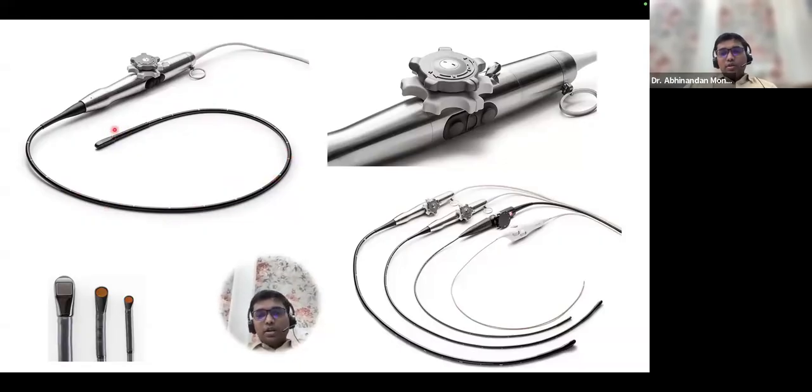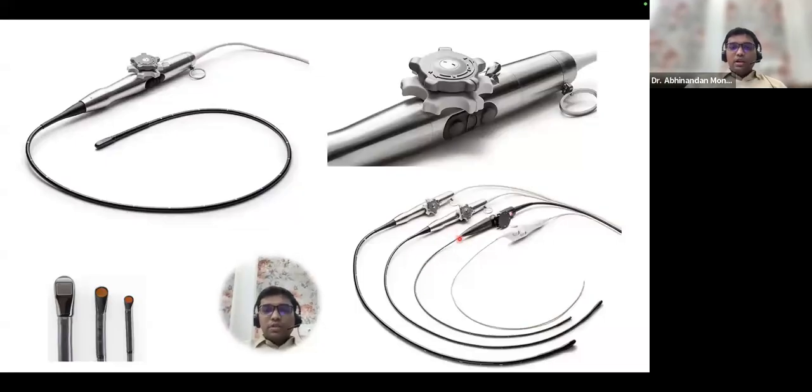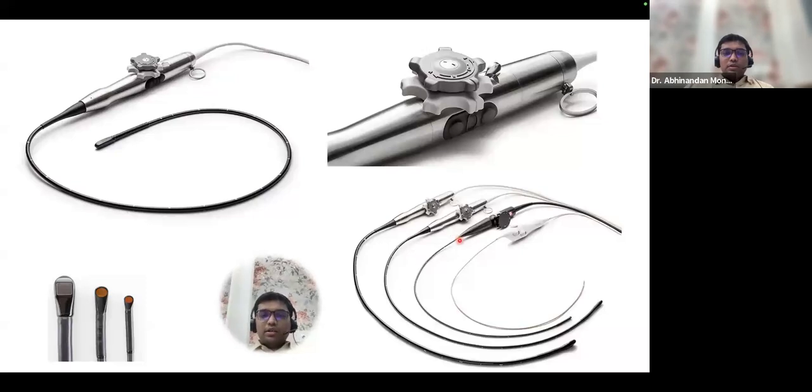And in case of pediatric, you can see in these images there are multiple pediatric options available right now. So that length is around 88 centimeters. It starts from 75 centimeters and goes up to 88 centimeters.